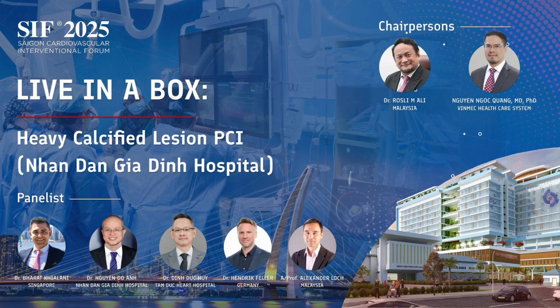But if I have the chance to do this case again, I wouldn't use the IVL balloon, because we all know there is also micro calcification crack. We didn't see the macro, but there is also micro calcification crack.